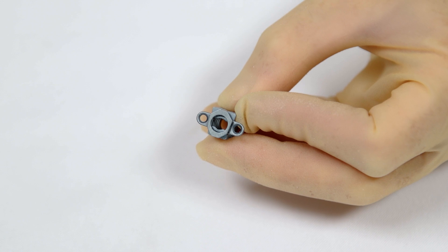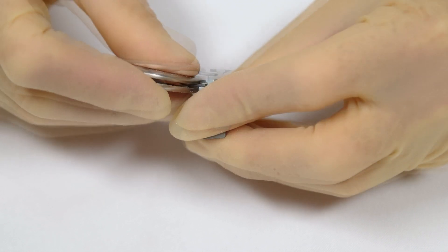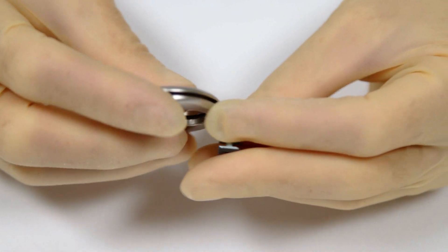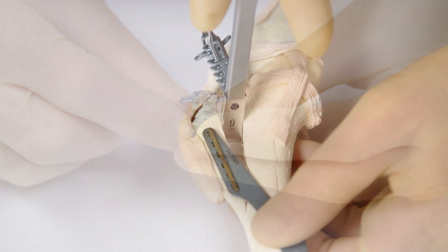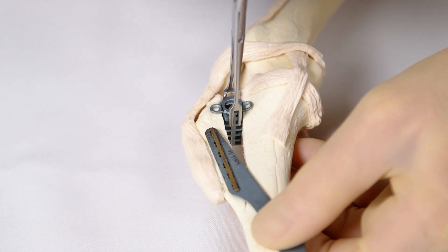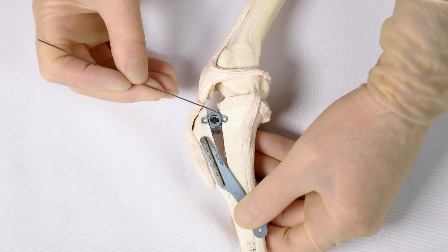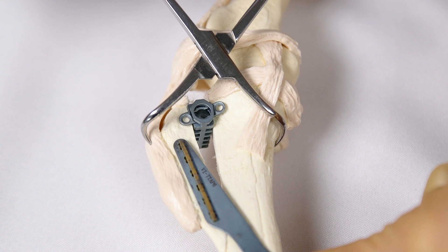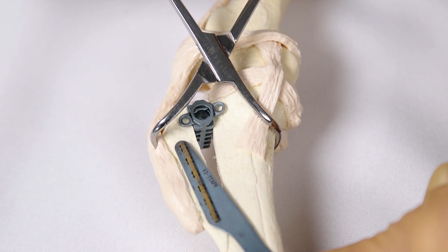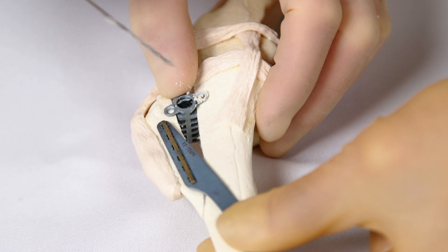When a good cage fit has been confirmed, remove the cage and use the oval plate bender to contour the cage ears. The caudal ear is bent medially or outwards; the cranial ear is bent laterally or inwards. Position the cage in the osteotomy with the wide aspect proximal and the narrow aspect distal, approximately 3 millimetres distal to the most proximal aspect of the caudal cut surface. With the cage positioned correctly, reduce and compress the advanced tibial tuberosity using a large pair of single point reduction forceps. Drill the pilot hole for the caudal cage screw using a 1.8 millimetre drill bit, aiming caudal and distal.